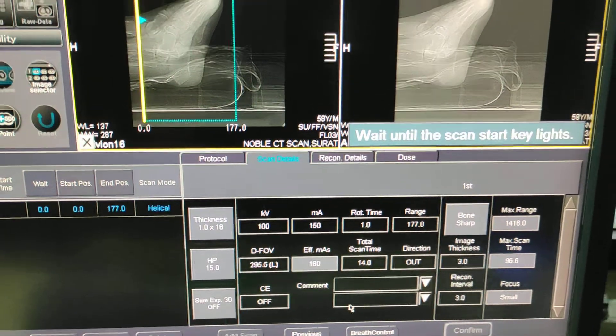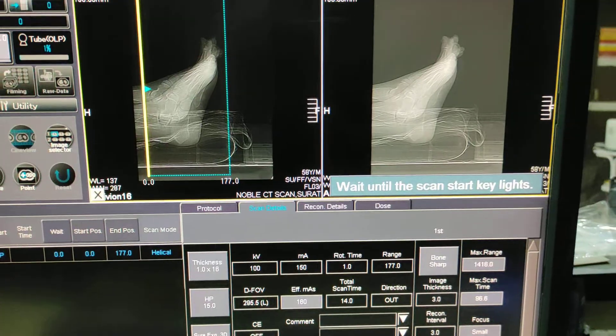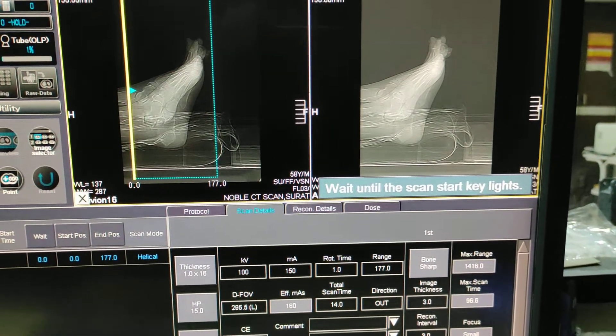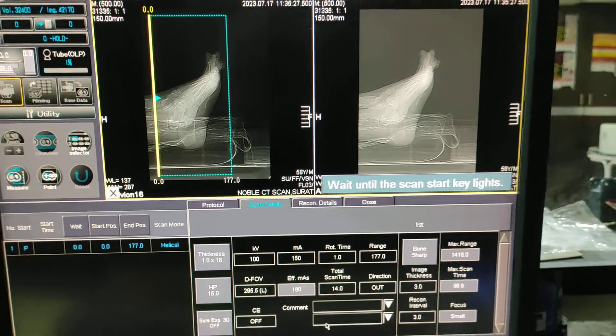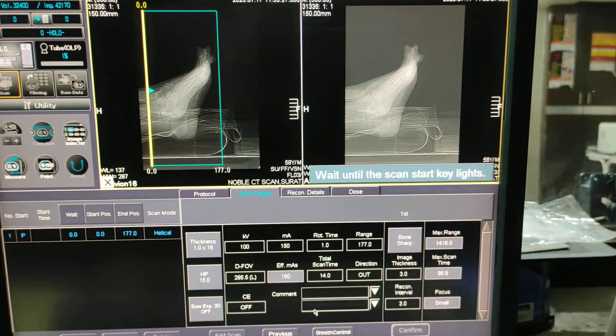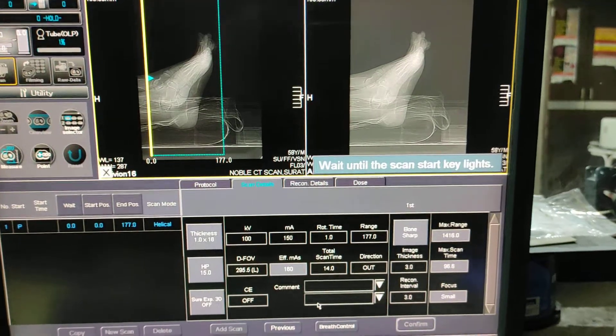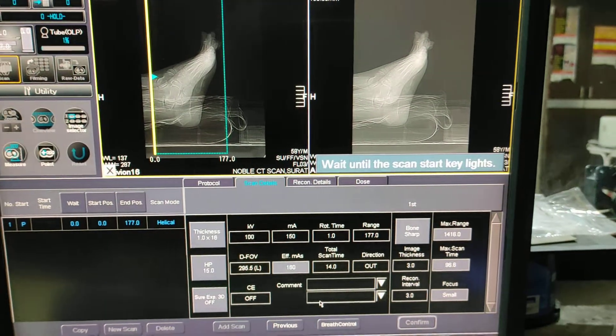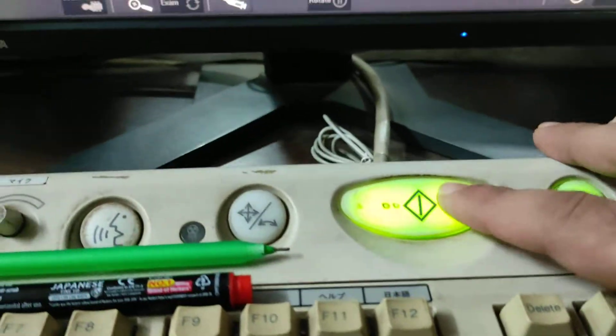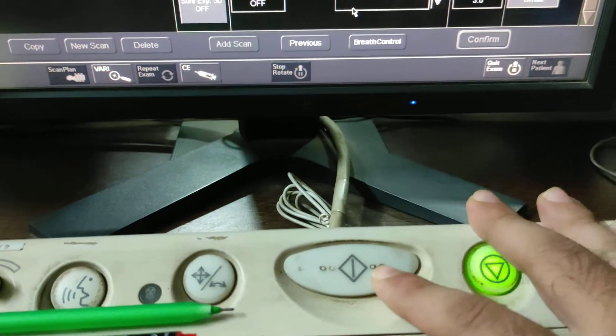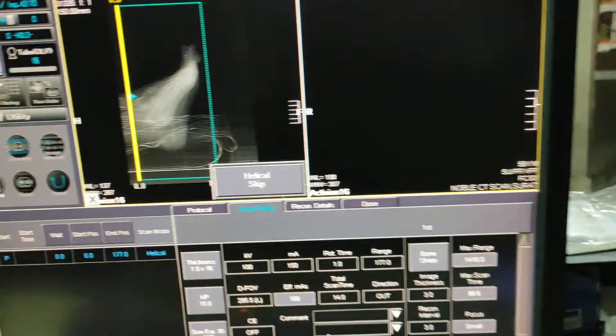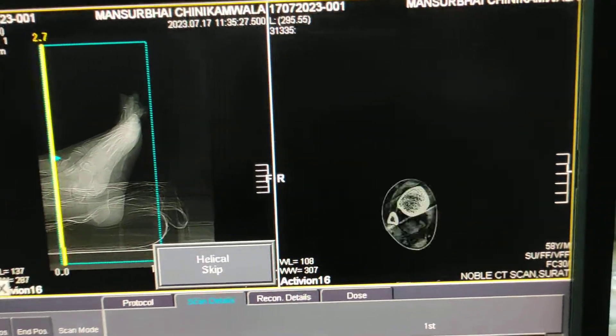Give proper instruction to the patient not to move between scan. Wait until the scan start key lights. You have to press two times. Scan is going on now.